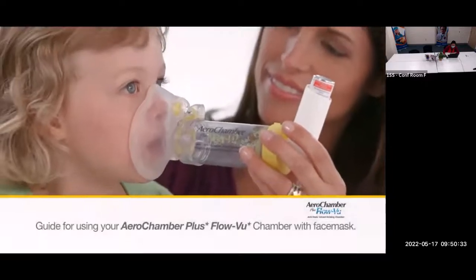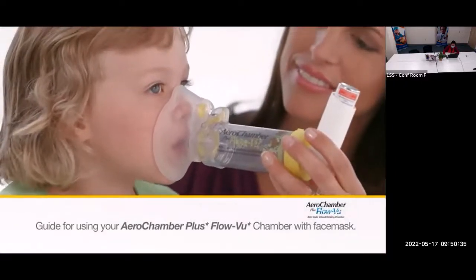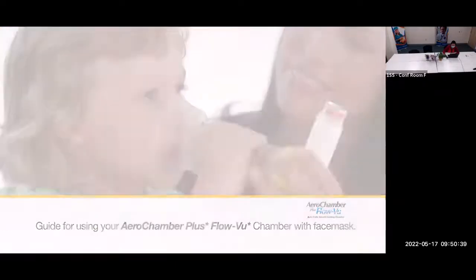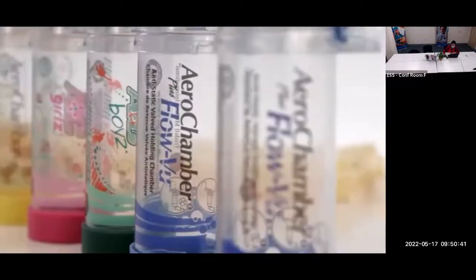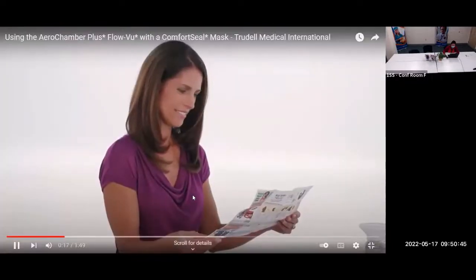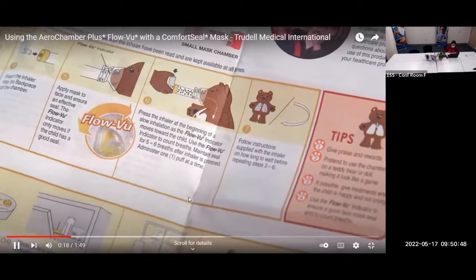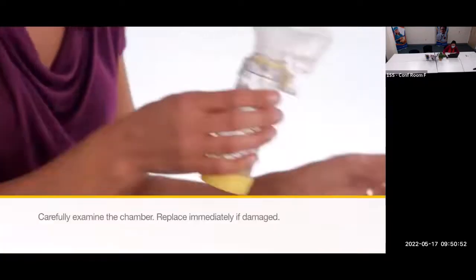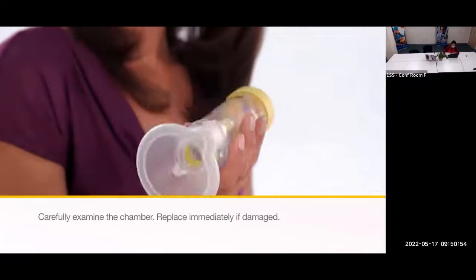Please follow these simple instructions when using AeroChamber Plus Flow-Vu chamber with face mask for your inhaler medicine. The chamber can be used right out of the package. Before use, ensure you have read the instructions for the chamber and metered dose inhaler. First, look at the chamber and make sure it is not damaged.